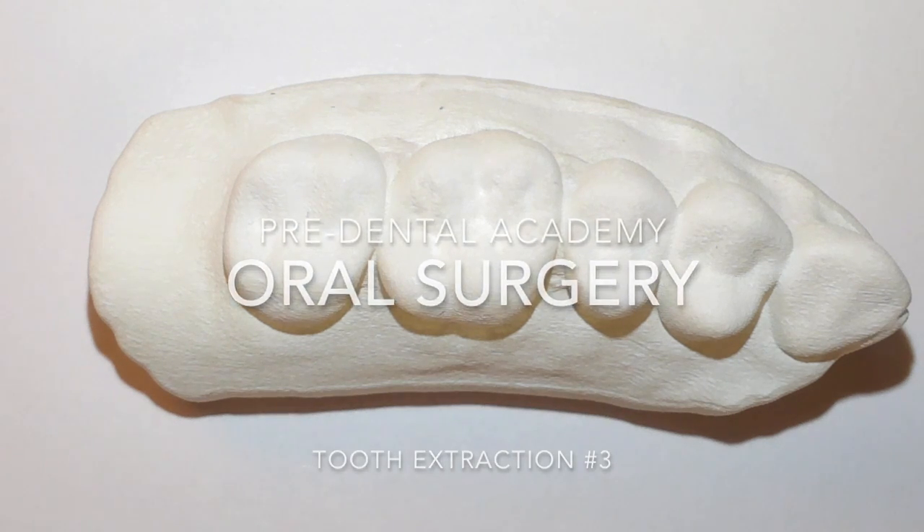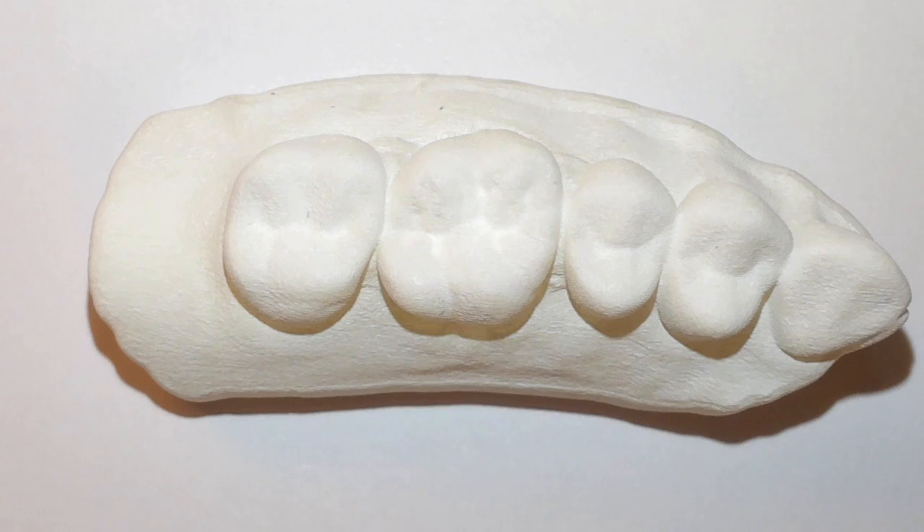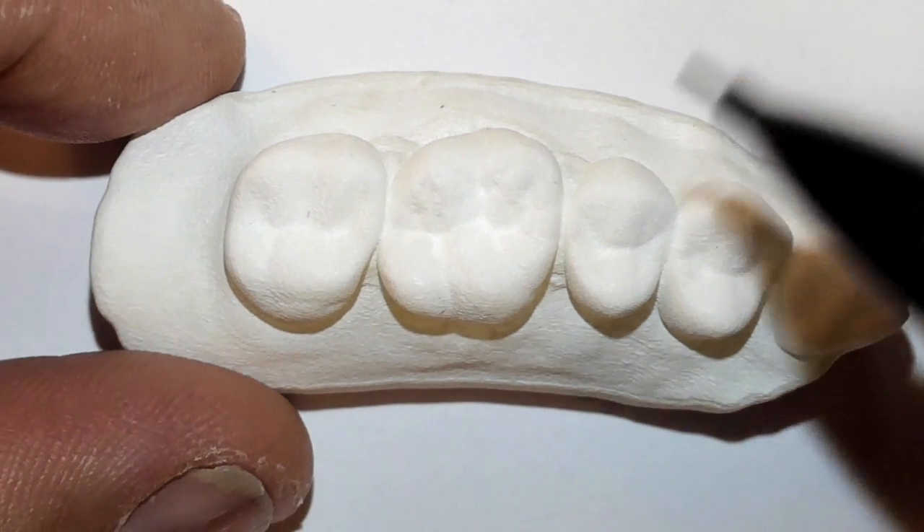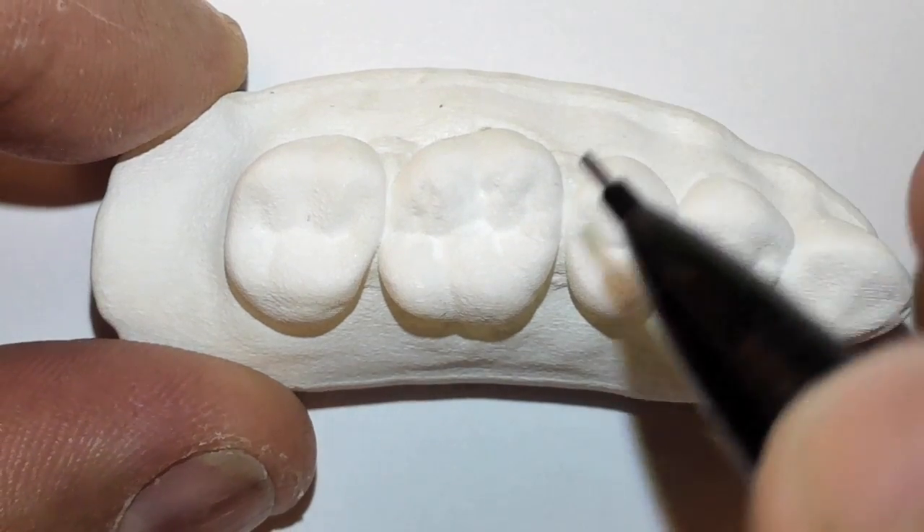Hello and welcome. This is Dr. Jerry Cuomo. I'm here recording a tooth sectioning procedure and I'm going to go ahead and outline.